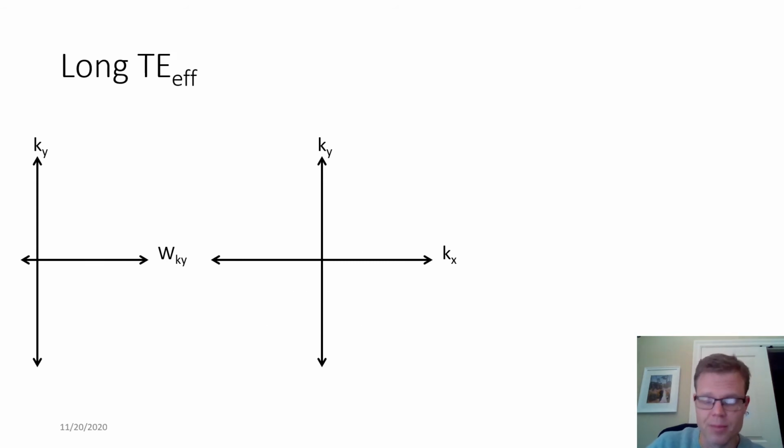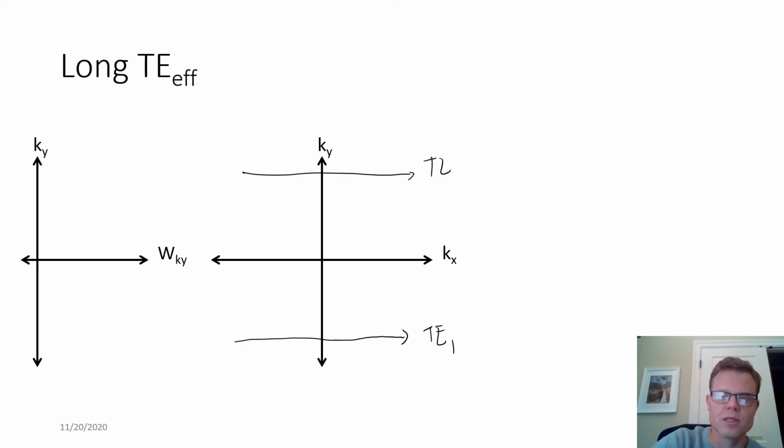But also a very common use case is to choose to cover the center of k-space at one of the longer spin echoes. And I'll just draw this in the extreme case, where we could start on both edges of k-space and then gradually move towards the center.